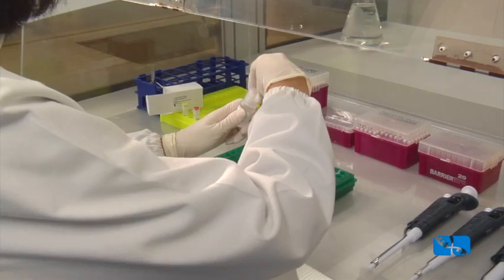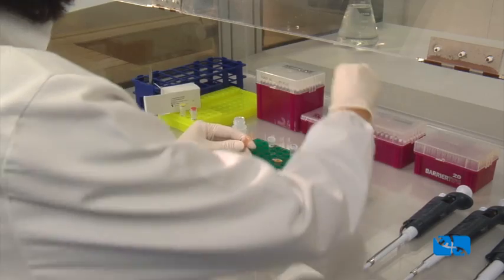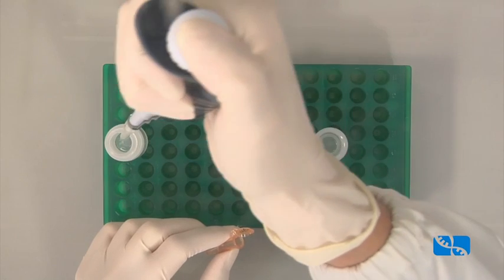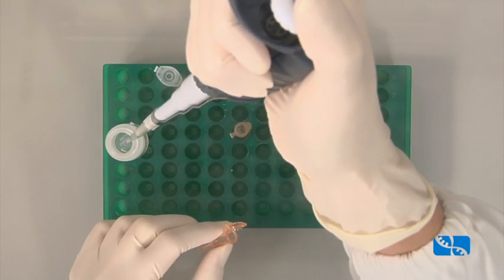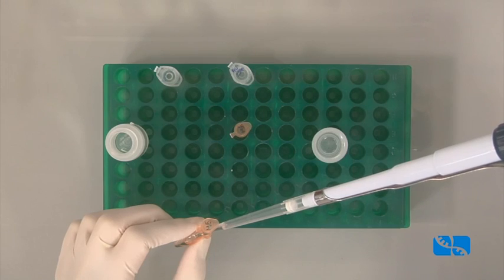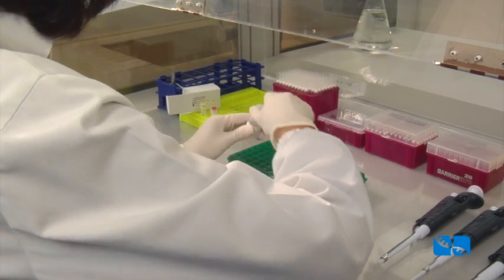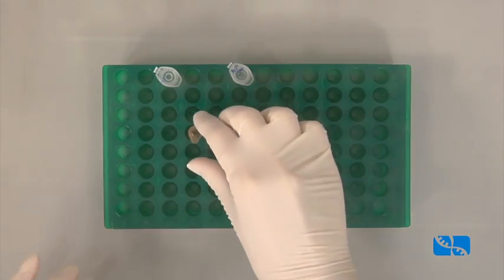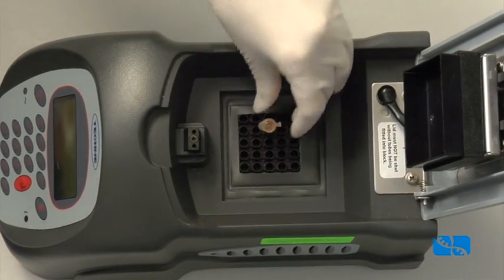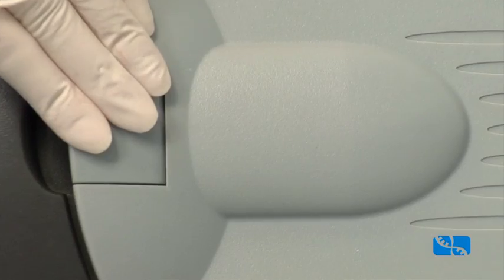Add 400 microliters of mineral oil. Tissue sections must be covered with the mineral oil. Then heat the tubes at 95 degrees Celsius for 2 minutes. In this step, paraffin will melt and mix with the mineral oil.